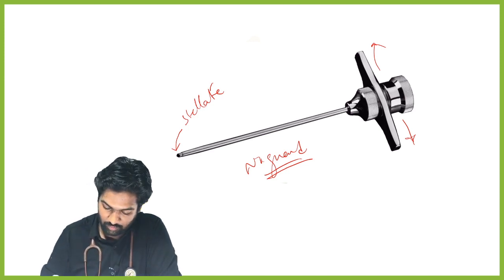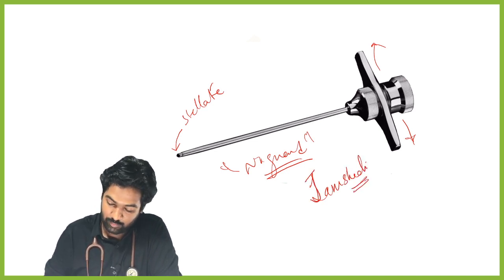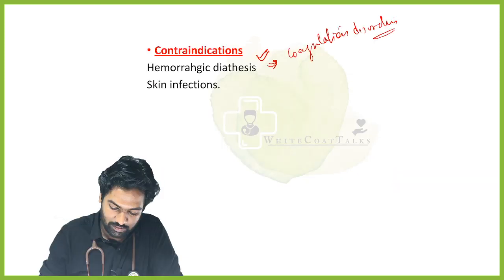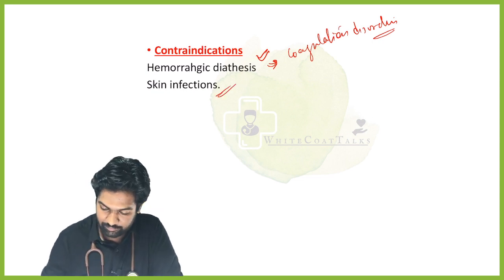This I have shown, this is Jamshidi's. What needle is this? A biopsy needle. Biopsy is obtained through it. Another contraindication is local skin infection.